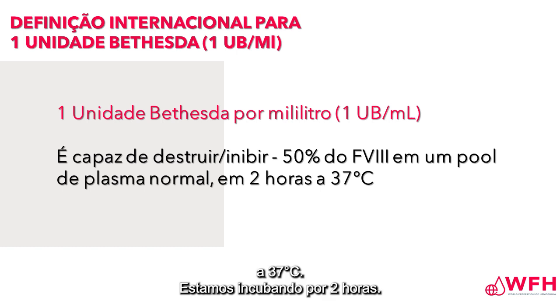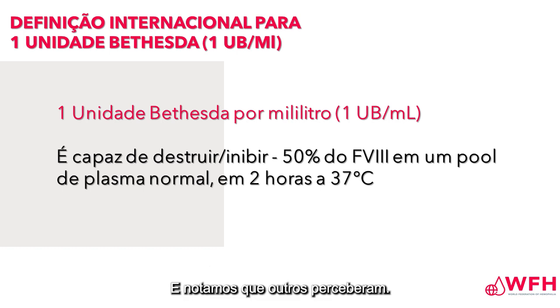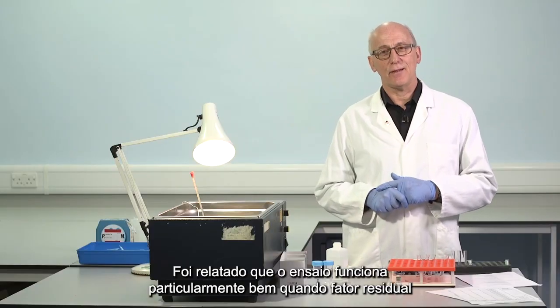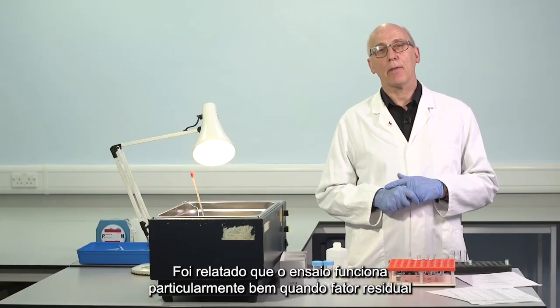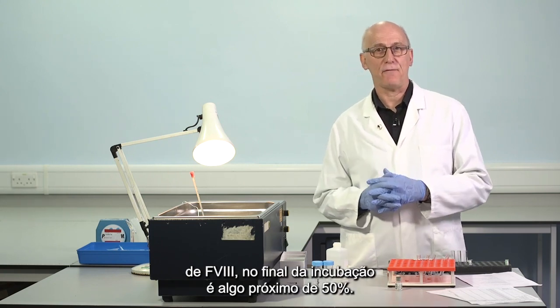We're incubating for 2 hours. So if the test, or IQC, contains 1 unit per mil, 1 Bethesda unit, we will have, by definition, 50% residual activity. And it's been reported that the assay works particularly well when residual factor 8 at the end of the incubation is somewhere close to 50%.